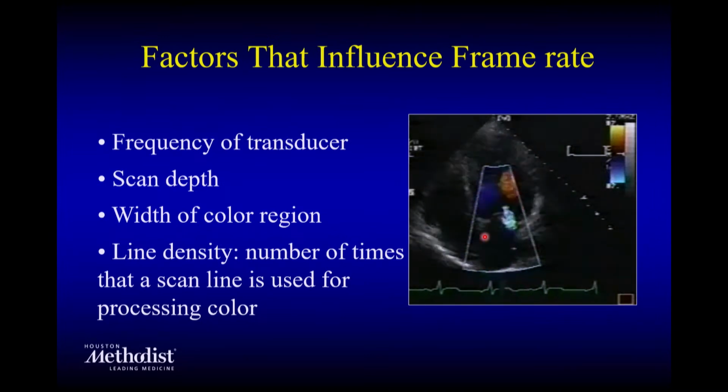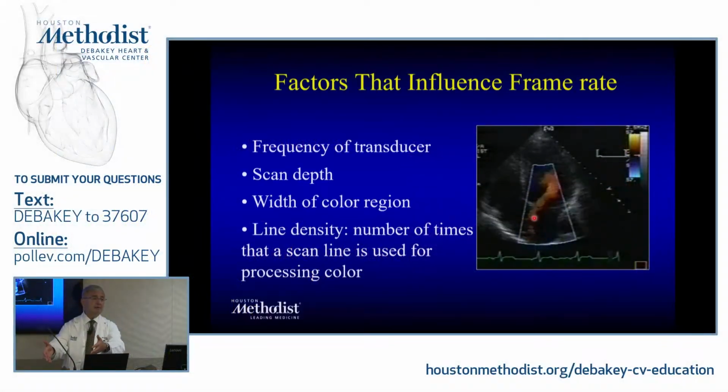The factors that influence frame rate are the frequency of the transducer and the scan depth. If my scan depth is way down, I'm going to have to wait too long. If it is wide, I'm going to have to process all this information, and your frame rate will drop. If the frame rate of updates is less than 15 per second, it will be very stroboscopic, so you don't want that.